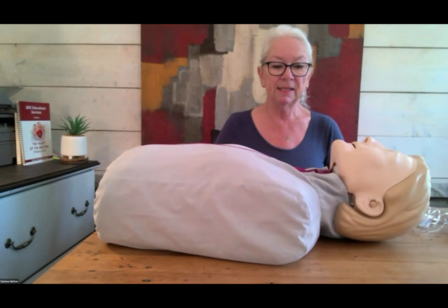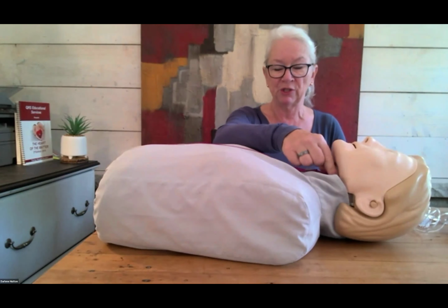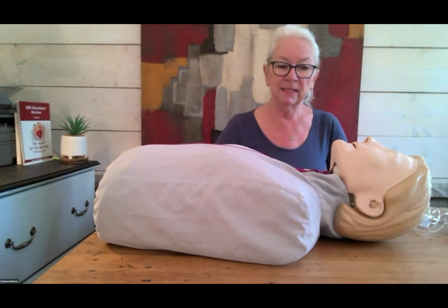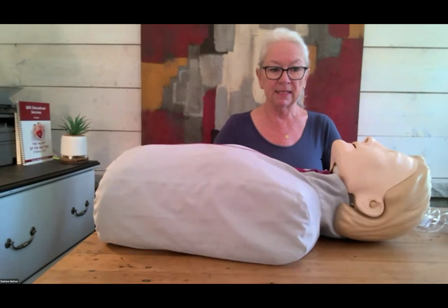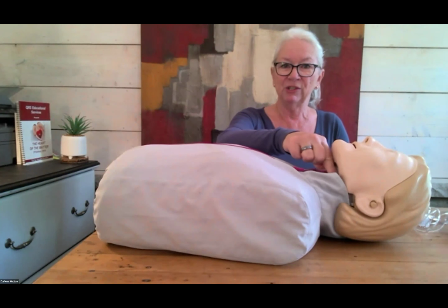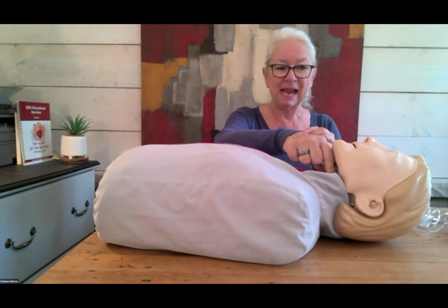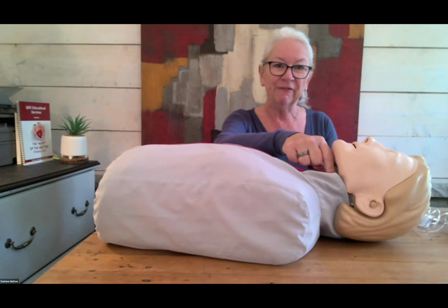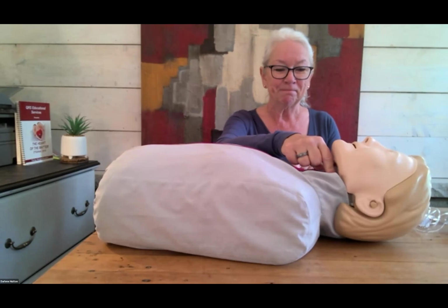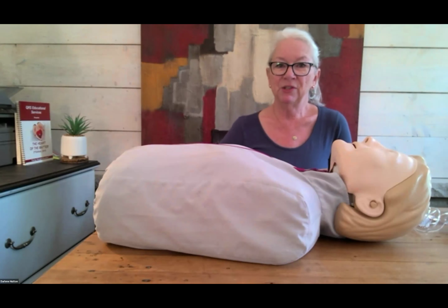The last P has to do with pressure. We're talking about the application of cricoid pressure. It's not something that is used on a regular basis, but if it is going to be used, the physician will often take your hand, guide you on the patient's throat, do a couple of different maneuvers, and when they have the right spot, meaning when they can visualize the vocal cords, they will ask you to keep your hand in that position. Keep applying that pressure until they've asked you to let go of it.